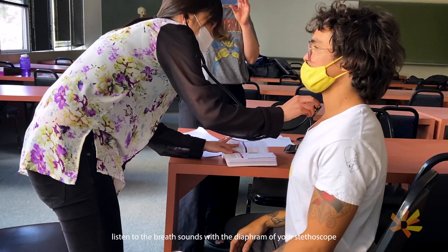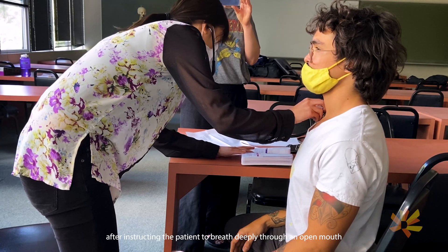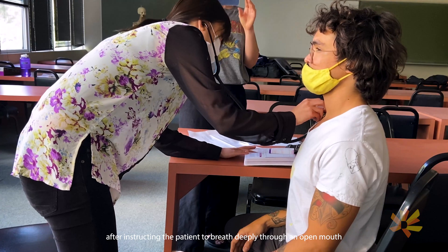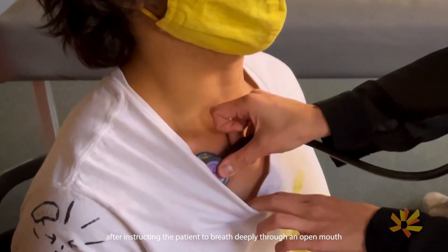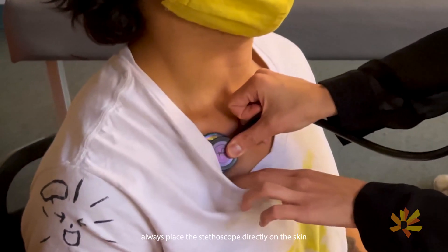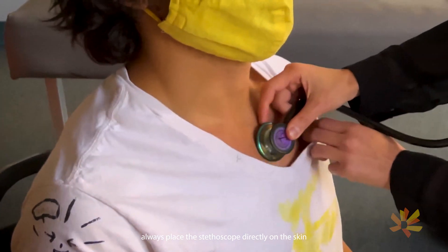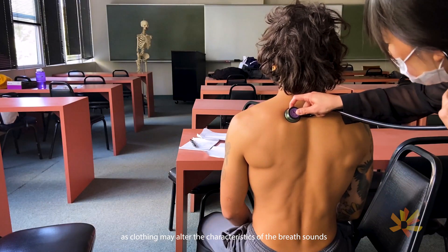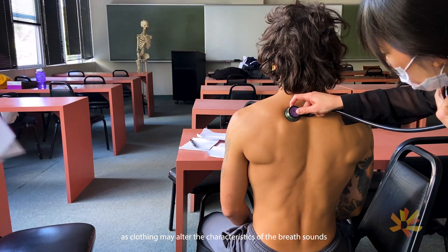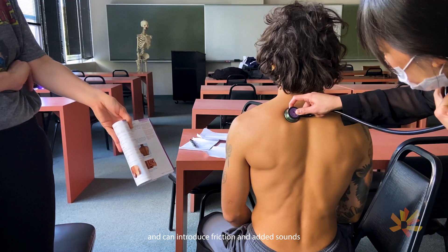Listen to the breath sounds with the diaphragm of your stethoscope after instructing the patient to breathe deeply through an open mouth. Always place the stethoscope directly on the skin, as clothing may alter the characteristics of the breath sounds and can introduce friction and added sounds.